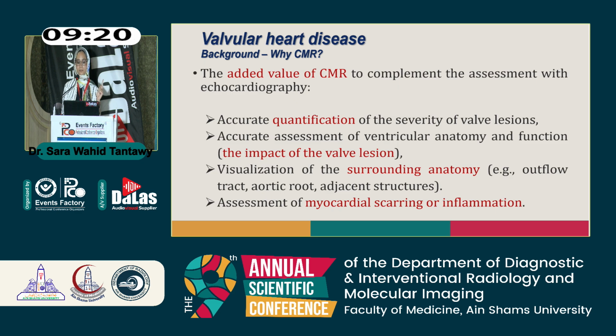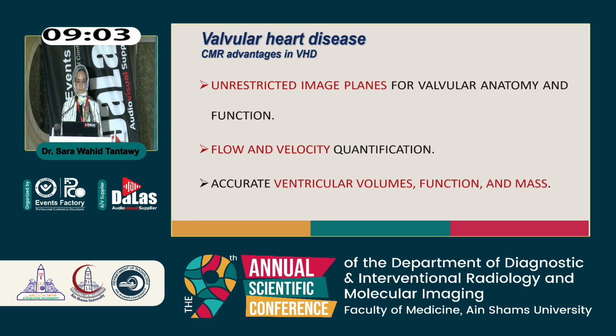That's the first thing. The second thing is we can know the impact of the valvular lesion on the ventricular system, the ventricular volumes and ventricular function. We can also visualize the surrounding anatomy like the aortic root and the aorta itself. We can assess the myocardial scarring and inflammation.